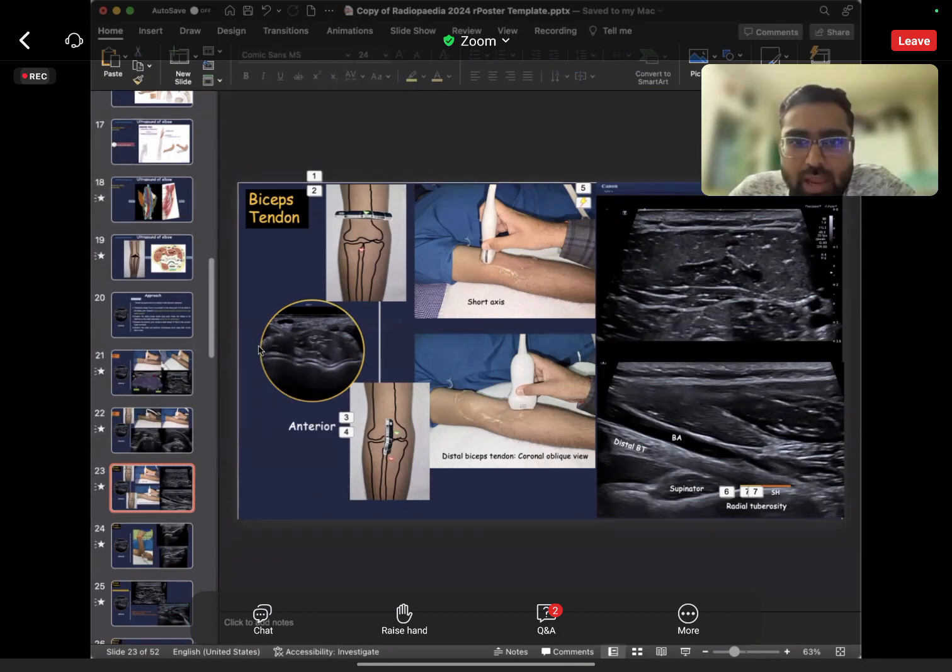But yes, we can differentiate, because I have shown you another approach to assess the common lateral extensor compartment, and how compression or other maneuvers will make it taut, so we can simply find out the structures.